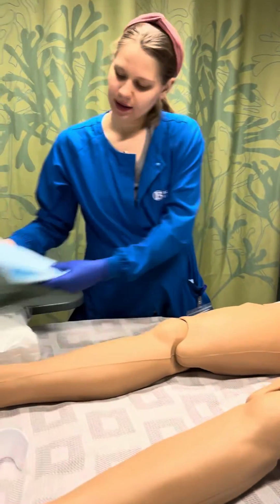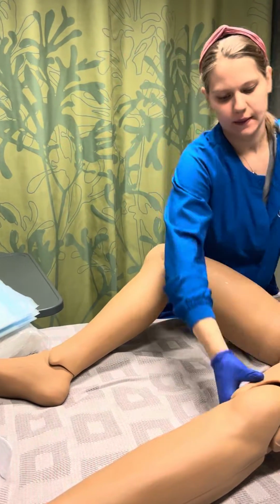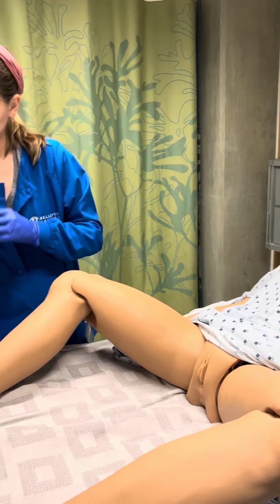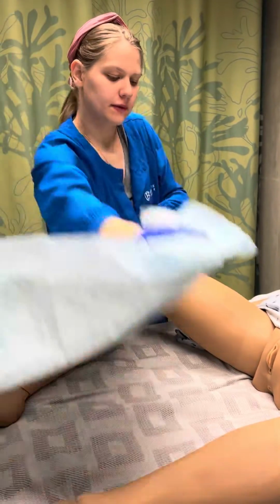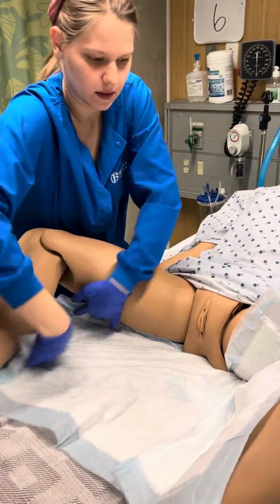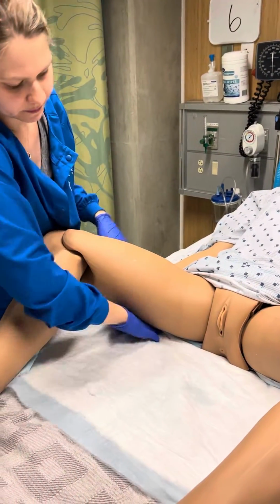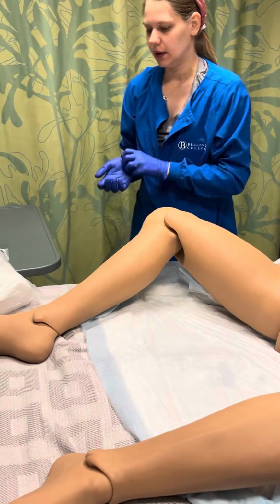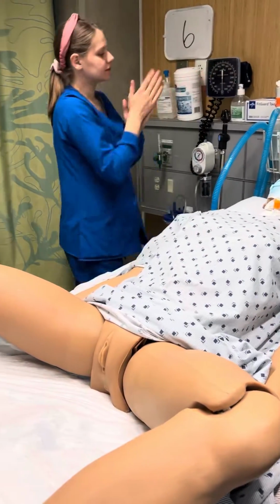Okay. And then if you could just move your legs to the side for me. All right. And are you comfortable? Good. And I'm going to tuck this under your bottom, okay? Can you lift your hips for me? Great, thank you. And then I'm going to remove my non-sterile gloves, perform hand hygiene.